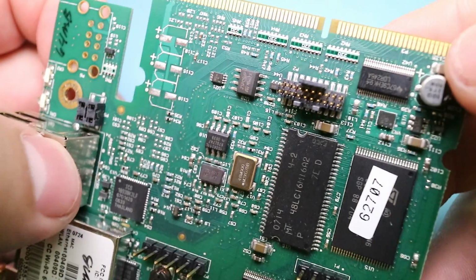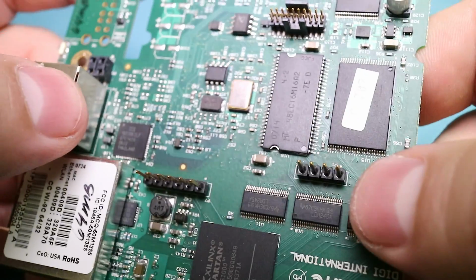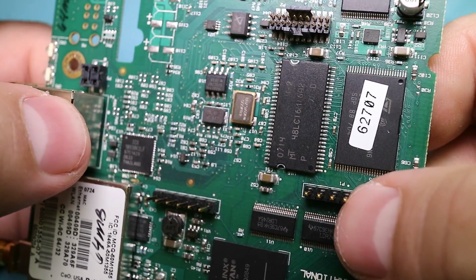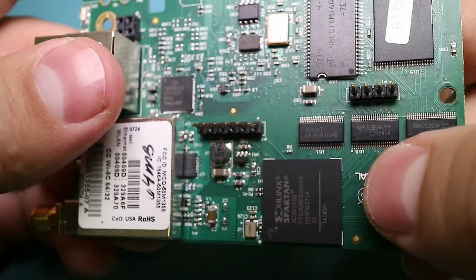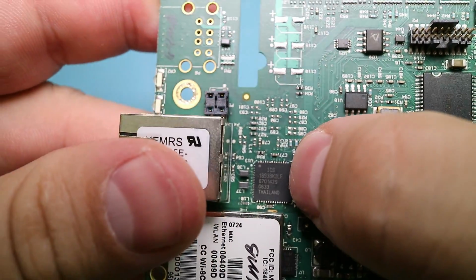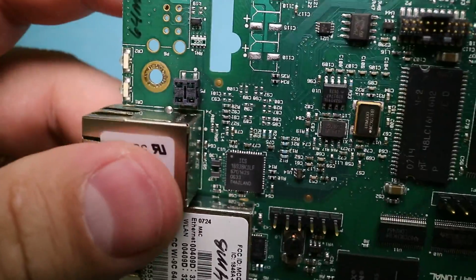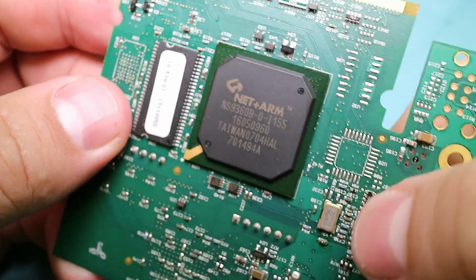Again, these are probably all expansion things that you can use, like probably GPIO and stuff like that. Something that is probably a programming header for the onboard flash. This is probably JTAG programming for the Spartan. Probably Ethernet, possibly also Wi-Fi. And yeah, it's just got this ARM chip on it, and it's running Windows CE.